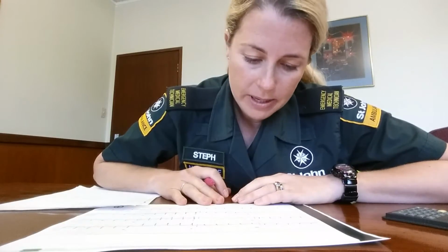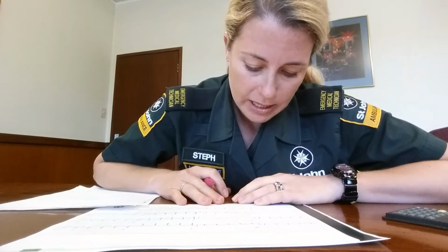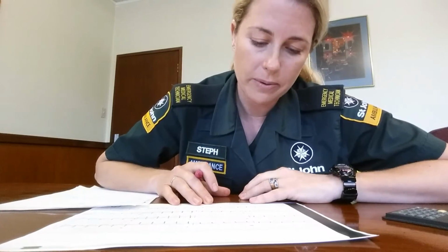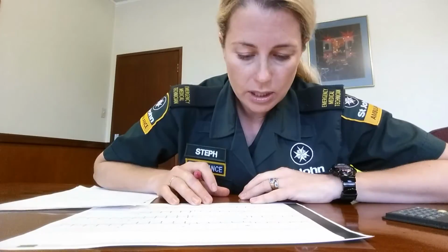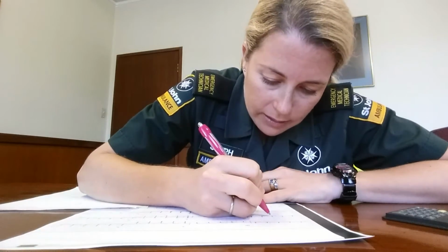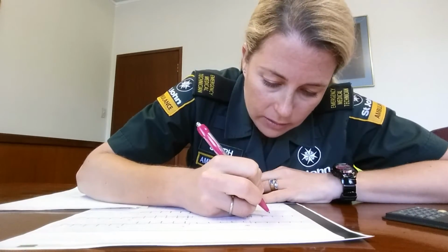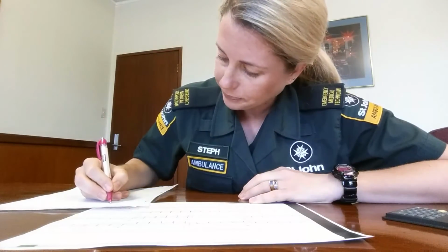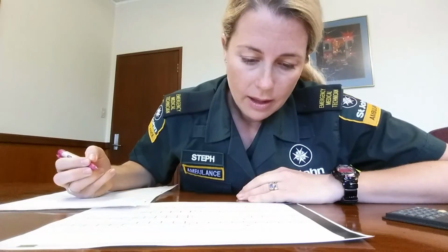My QRS complex, I'm looking for it to be less than 0.12 seconds, so normal 0.06 to 0.11 seconds, which it is not wider than that. It is about 0.11 seconds, which is normal.